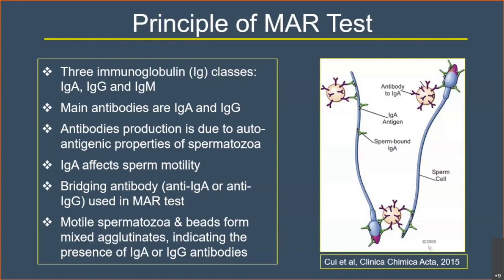And it can be tested against both IgA and IgG antibodies. And the binding of the beads indicates the presence of IgA or IgG antibodies. Next slide.